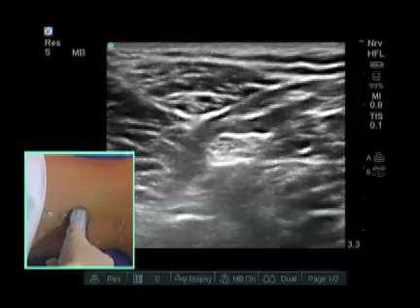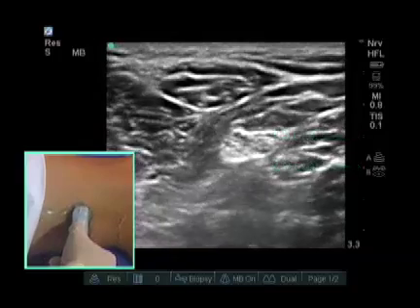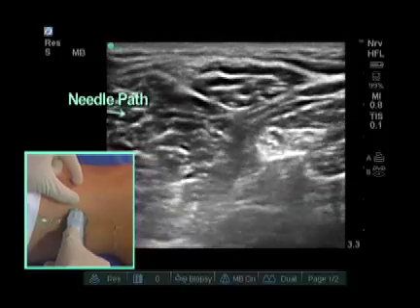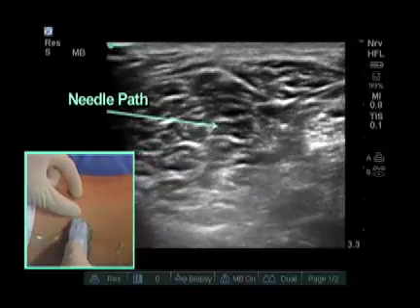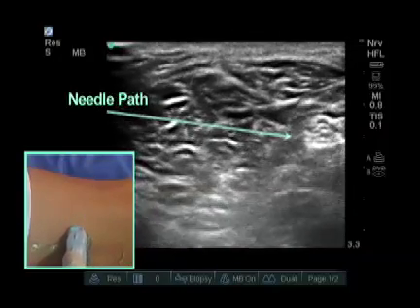My needle approach for these blocks is going to be from lateral to medial. What I typically do is measure the depth of the sciatic nerve. Here the sciatic nerve is approximately one and a half to two centimeters deep to the probe. With that depth, my needle is going to come in completely perpendicular and have a very bright view of the needle and needle shaft as it advances to the nerve.